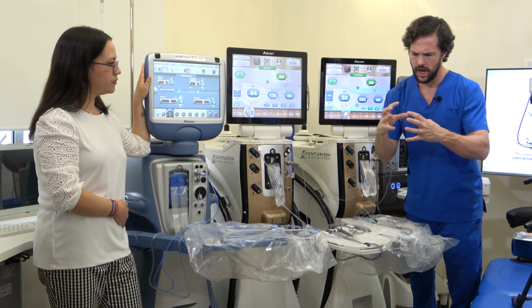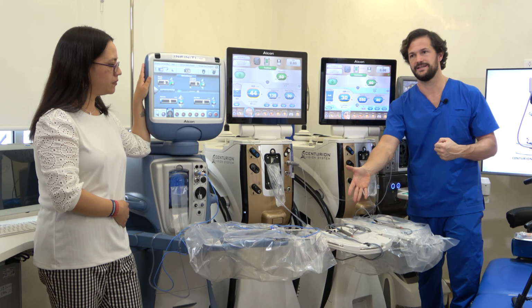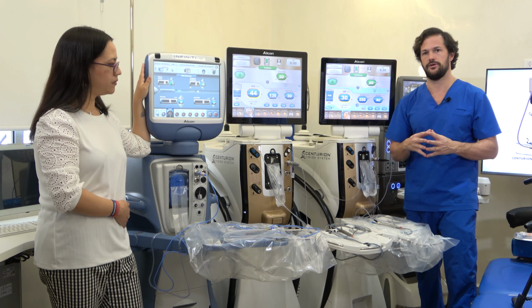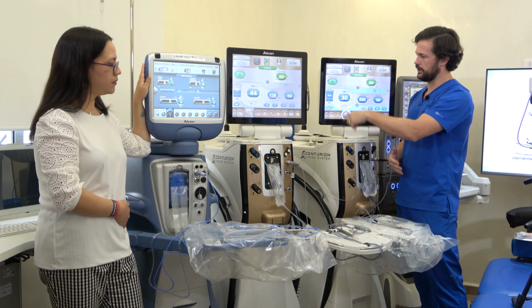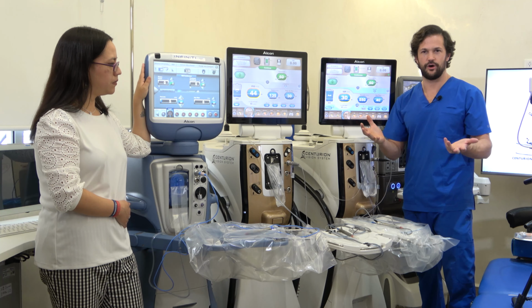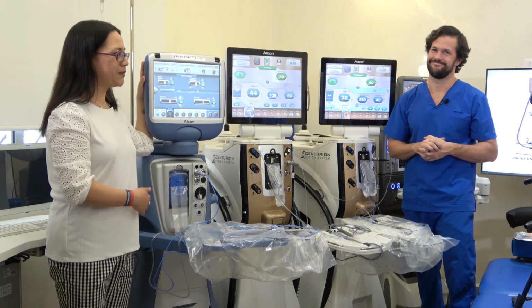We're more about having a controlled IOP in the anterior chamber with the balance tip. Since we have better sensors inside the anterior chamber, we can respond more quickly, and we can get those IOPs lower and lower to have better outcomes for our patients. Totally agree.